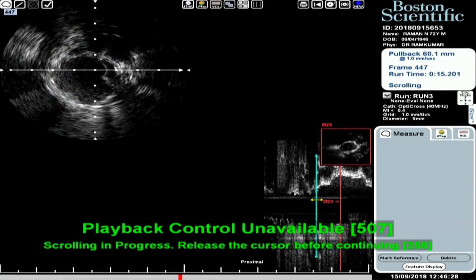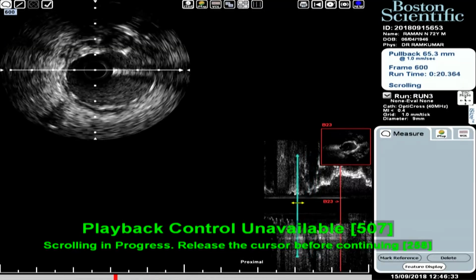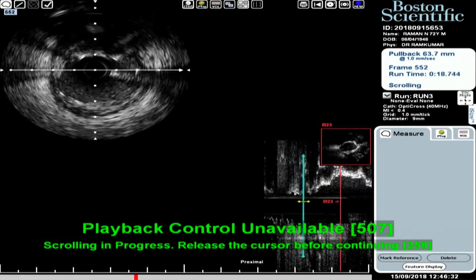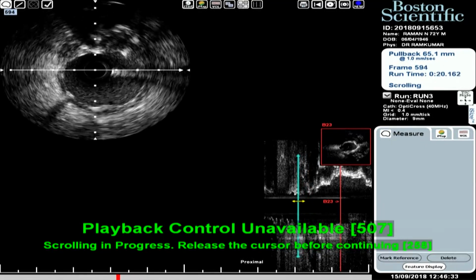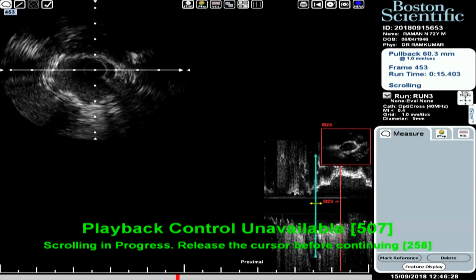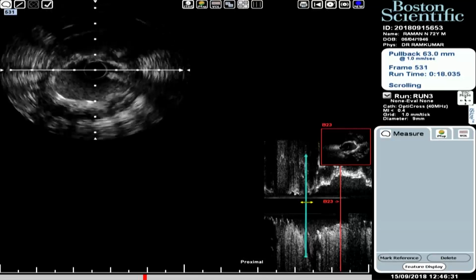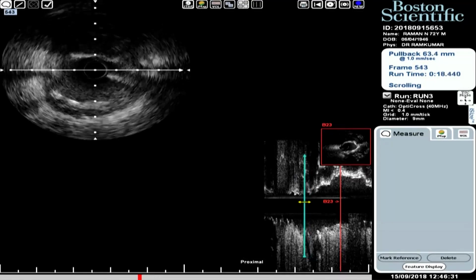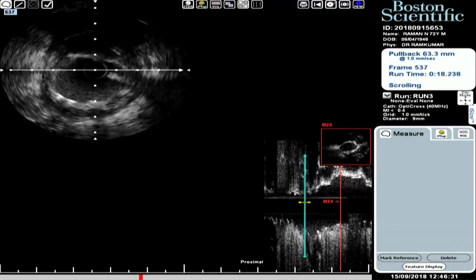So just keep playing. Yeah, you can see that the distal part of the left main stent is not expanded well. So maybe we could have kept it a little bit inner. Ideally you have to keep that marker in front of the carina. Then we could have gone a little bit in with a 4 millimeter balloon. Anyway, we'll put a 3.0 and go high pressure there.